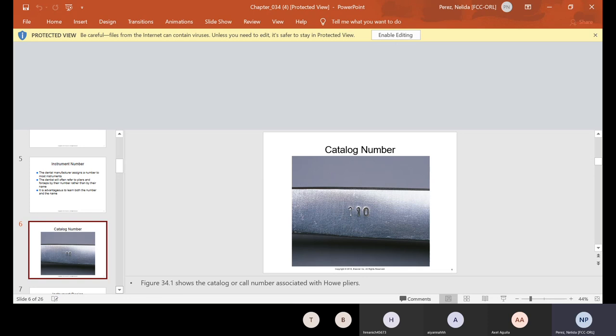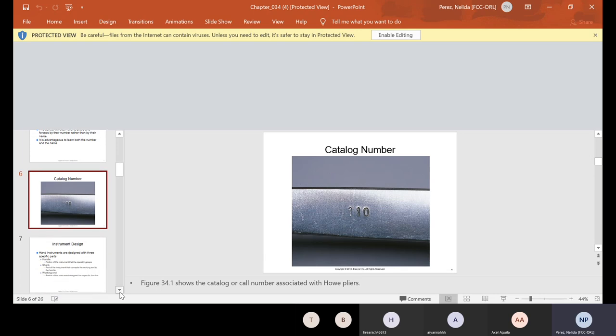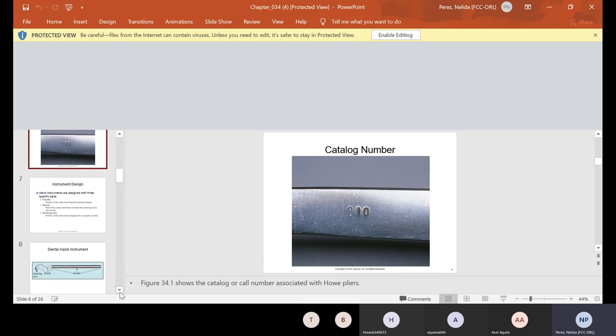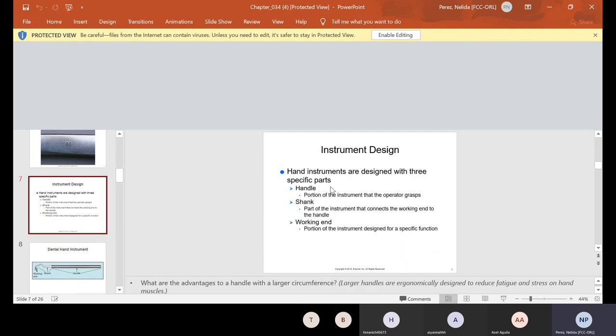For instance, this would be inside one of the instruments. As you can see here, it's number 110. If the doctor doesn't call it 110, he will call it by the Howe pliers. Most doctors that I've worked with call it by the Howe pliers. And so it's really advantageous for you to know both. And once you get into the office, you'll know if they like to call them by numbers or by names.